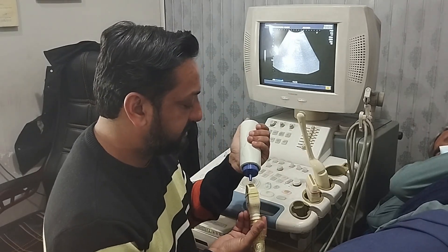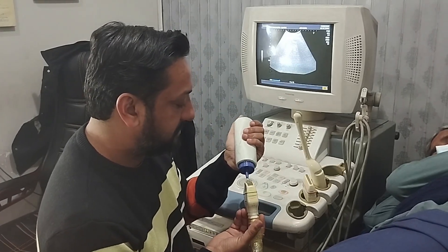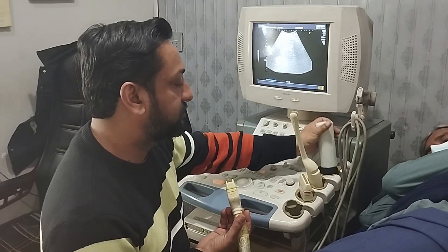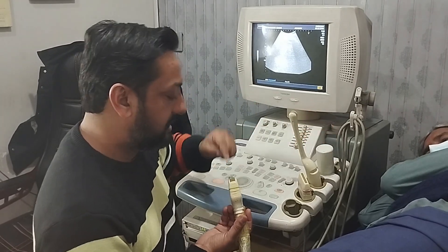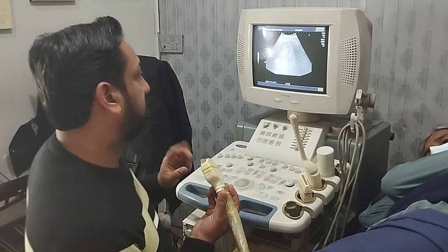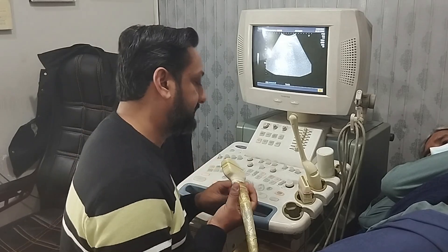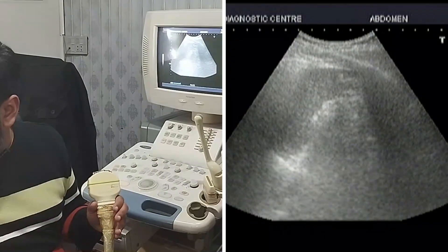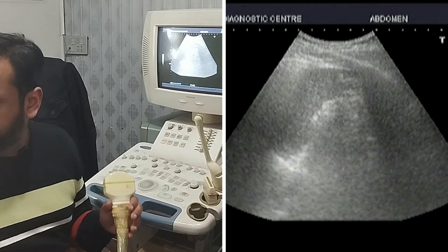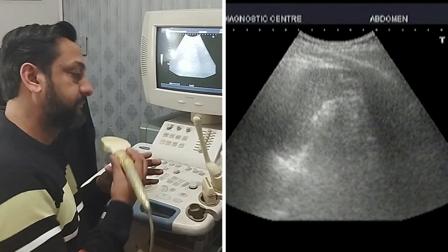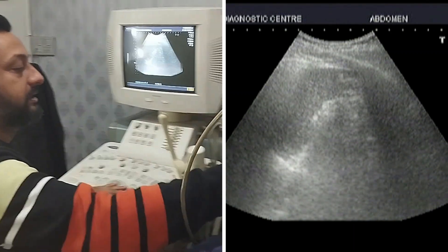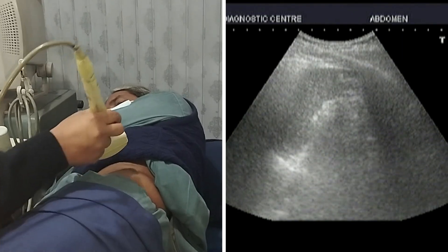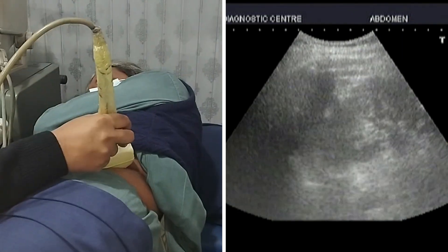I am going to apply the gel, making sure that the tip of my gel bottle is not touching the upper surface of my probe so it should not be damaging it. Let us start with the scan.